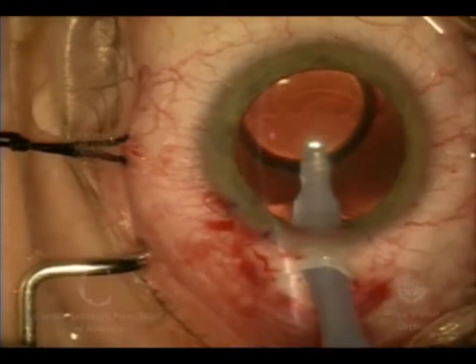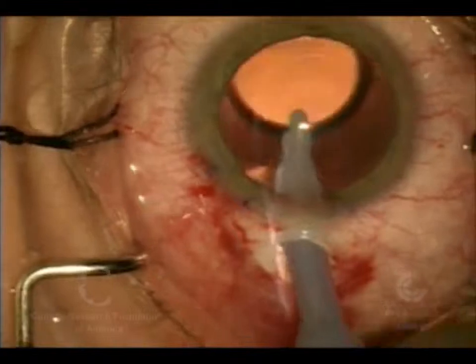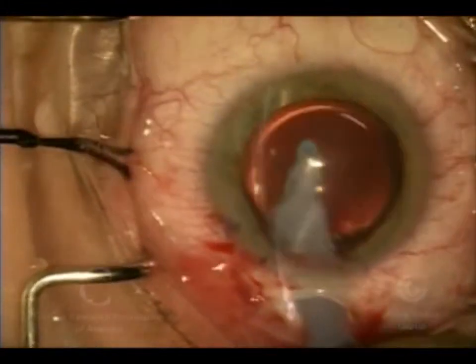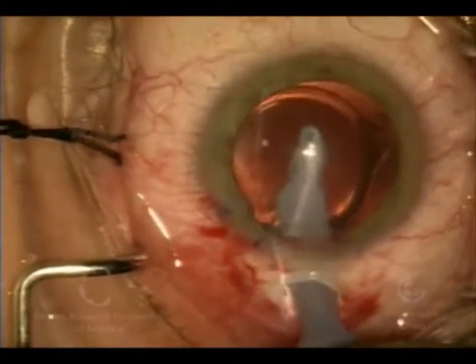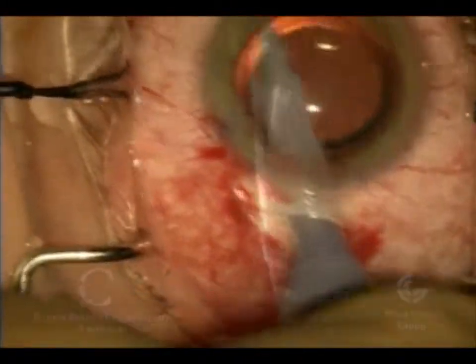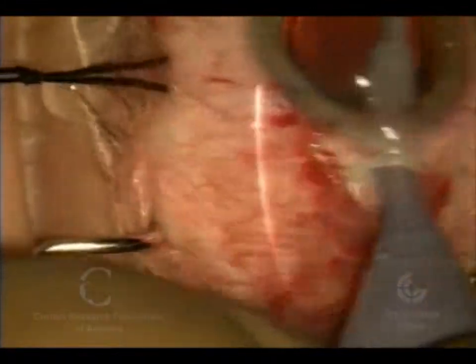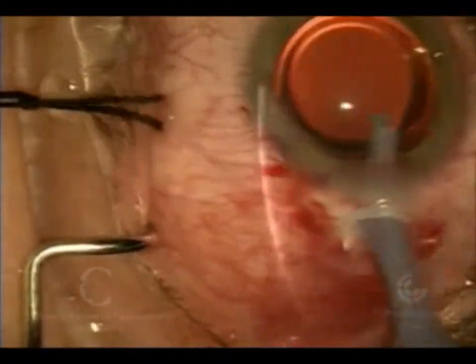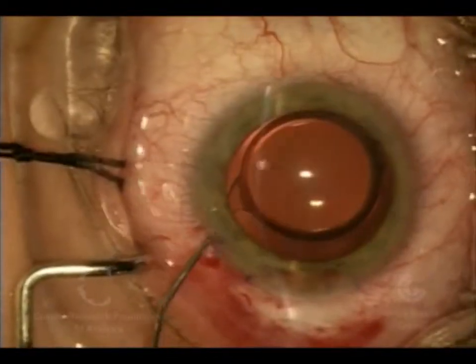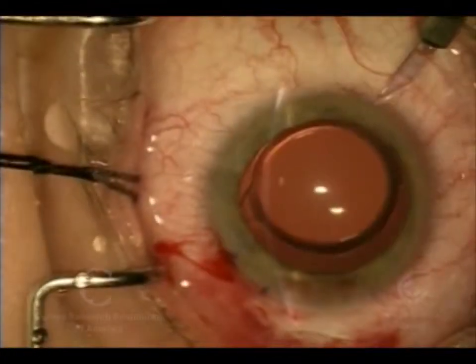I've placed the irrigation-aspiration tip back in the eye, and this time we're going to remove not part of the cataract but the viscoelastic material we put into the eye — first that which is behind the lens implant, and then all the rest in the front part of the eye. Now I'm going to vacuum off any viscoelastic from the back of the cornea so we don't get haze postoperatively.